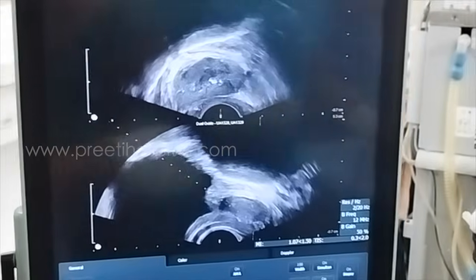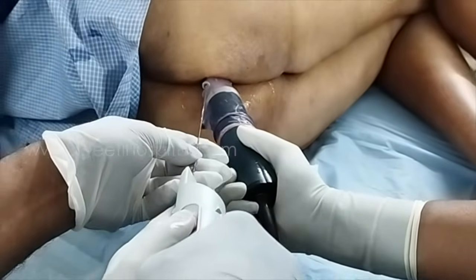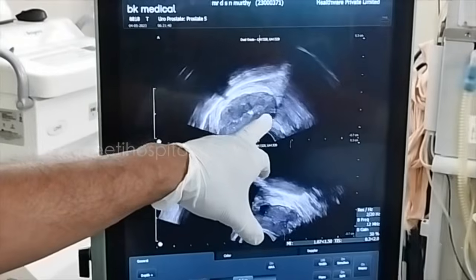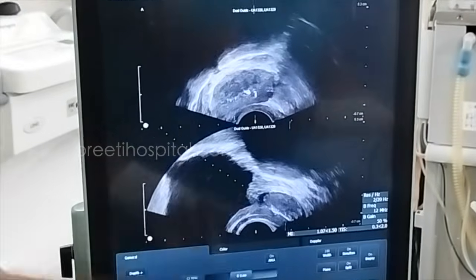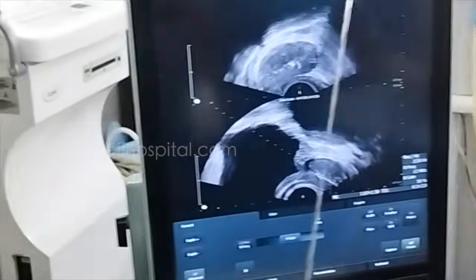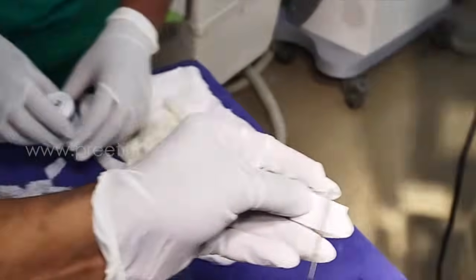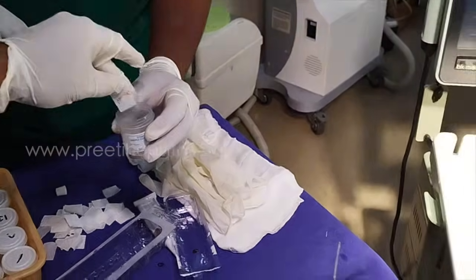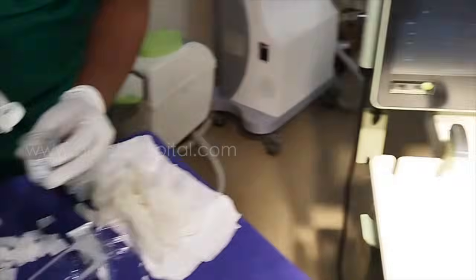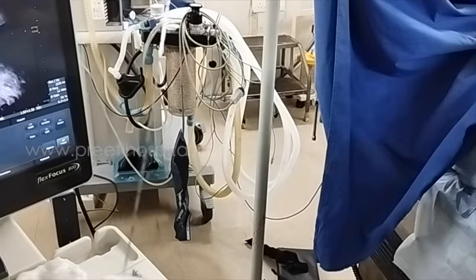Now left side, base, medial. I'm taking the shorter one. Okay, sorry. Left base here. See, left base periphery towards the urethra. Now the patient is not wincing. That means you are not hitting any part of the nerve. Can you see the piece clearly? It has come. Now this is the medial left base.